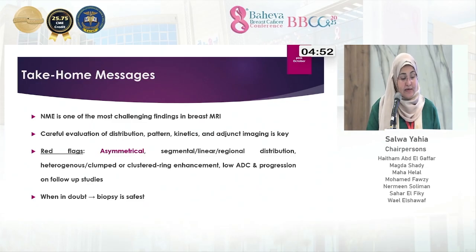Take-home message: non-mass enhancement is one of the most challenging findings in breast MR. Careful evaluation of the distribution, kinetics and adjunct imaging is the key. Red flags include asymmetrical, segmental, linear, regional distribution with heterogeneous, clumped or clustered ring enhancement, low ADC, progression on follow-up studies. When in doubt, biopsy is safest.